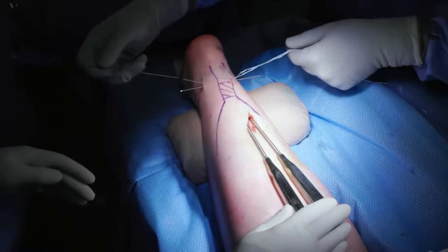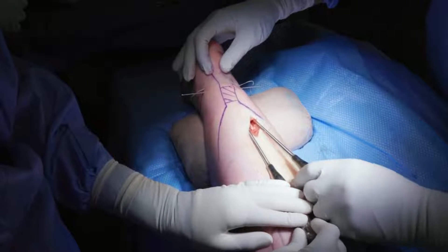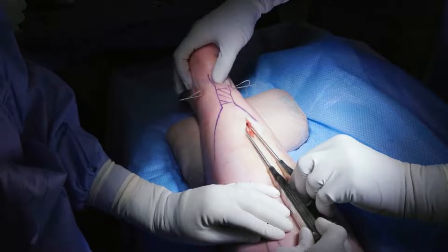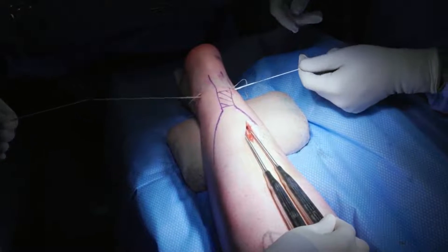A second, more proximal needle is inserted. The thread of suture number 1 is pulled through the path of the first needle, and effective placement of the second needle is then confirmed. The thread of suture number 2 is crossed through the path of the second needle.